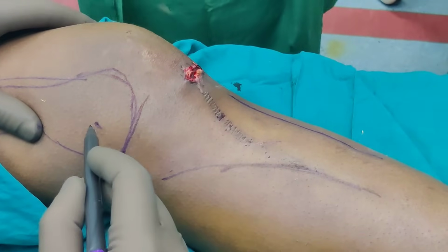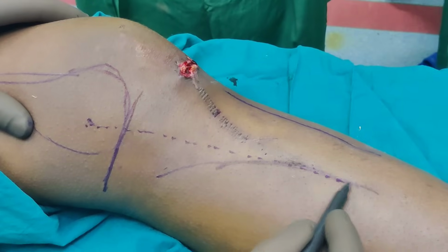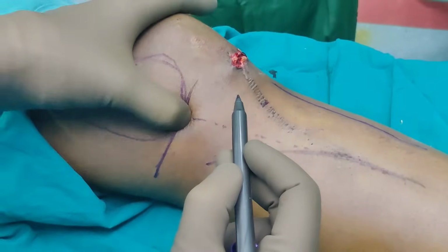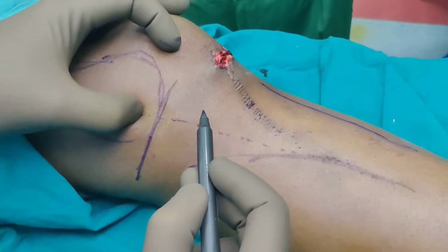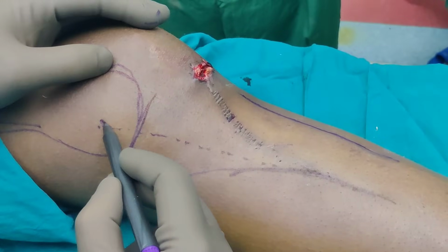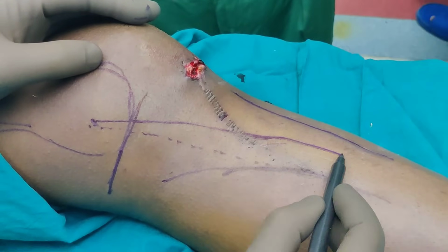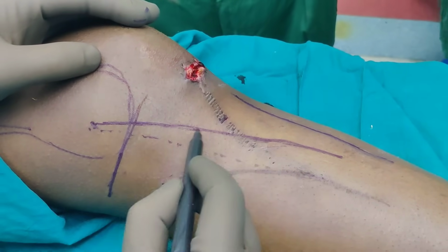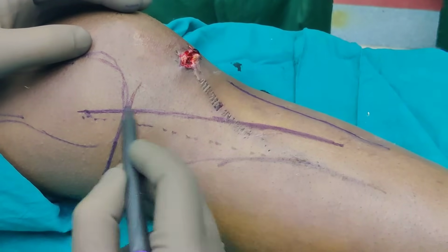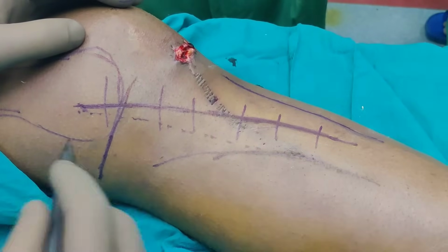So for a posteromedial approach, your incision would be something like this, just going parallel to the posterior border. But for this, you can, in the books you will read, start above the joint. I don't intend to open the joint, so I am just going to remain below it, but you can start above and you want to be in the center. So it will be slightly more anterior than your conventional posteromedial approach. So this is your skin incision, and you can use it depending upon how far your fracture extends.